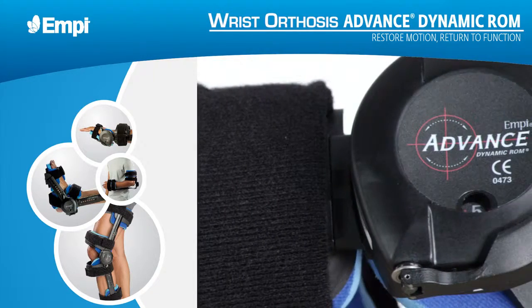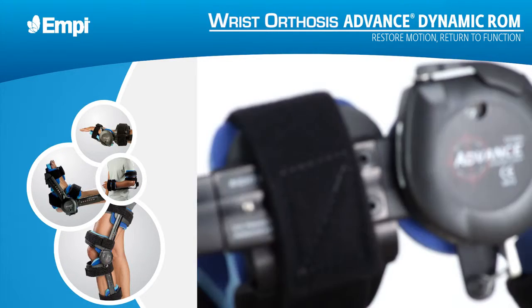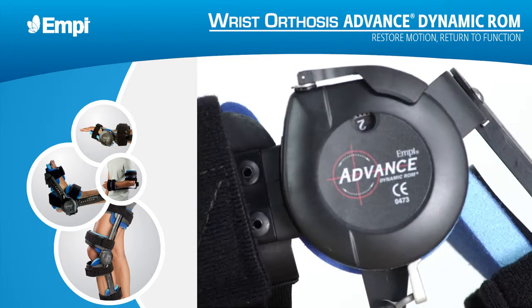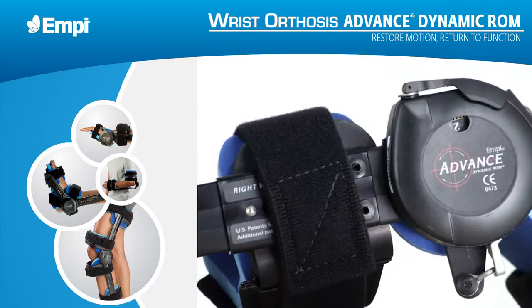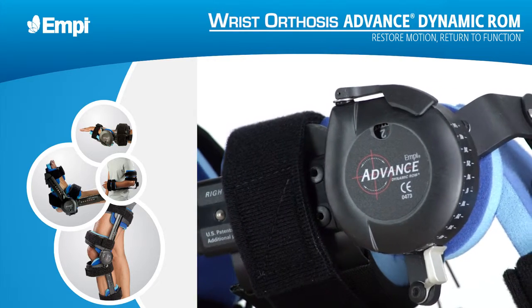The EMPI Advanced Dynamic ROM Wrist Orthosis, part of the EMPI family of dynamic splinting devices, applies a low-load, progressive stretch to the wrist to help increase a patient's range of motion. The instructions in this video are designed to help ensure that patients receive the maximum possible benefit from their range of motion therapy.